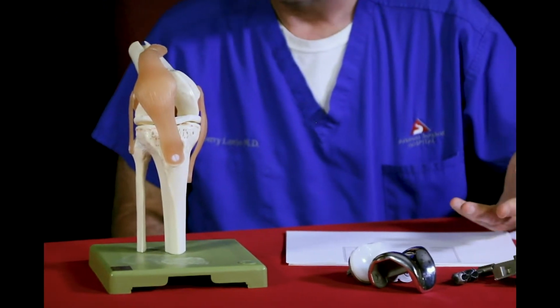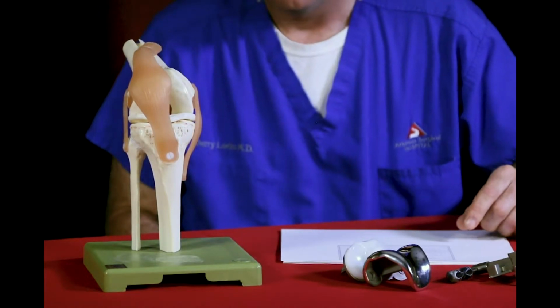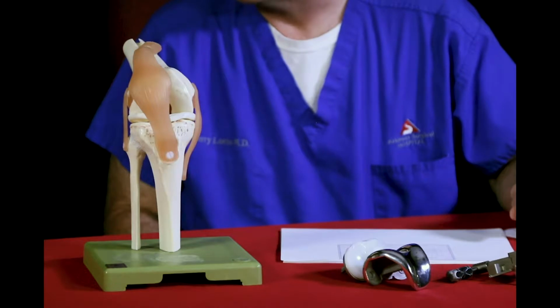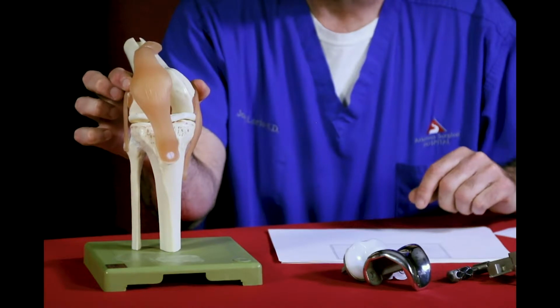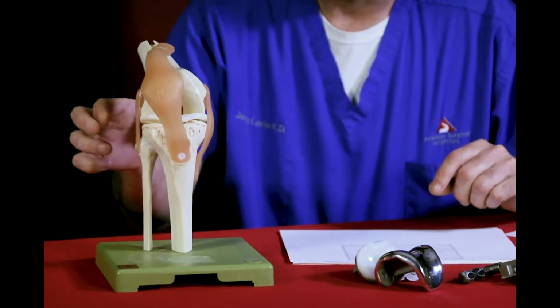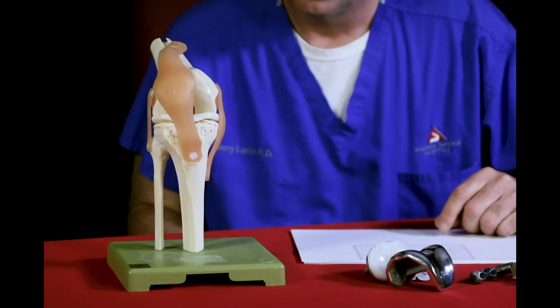Ours can be anywhere from 0 to 10 based on the patient's gap, and I think we averaged 4.9 in the study I did years ago. So it's very variable. Wow. And that's one of my tricks of the trade. Other guys palpate these epicondyles and determine that axis to get the rotation. My fingers are big. I can never really tell where that is.